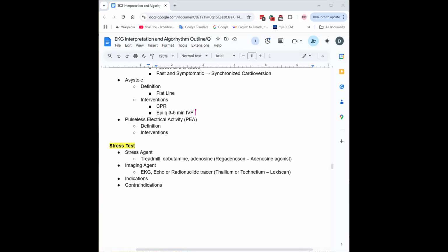Let's see. We can hook the defibrillator up to assess electrical activity, if there is any. If rhythm returns, yeah, so that's why you're doing your rhythm checks as well. So your 2 minutes of CPR, I believe that's about 5 cycles if I remember correctly, followed up by a pulse check. You can also connect the defibrillator to check, and if it goes into another rhythm, like maybe a shockable rhythm, then by all means.